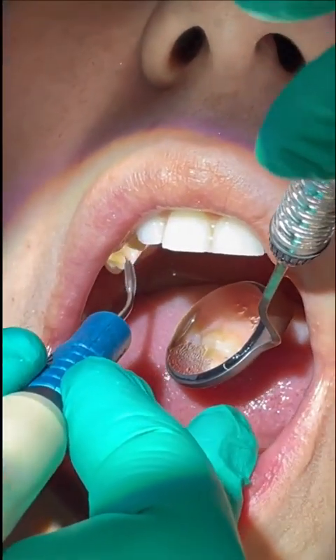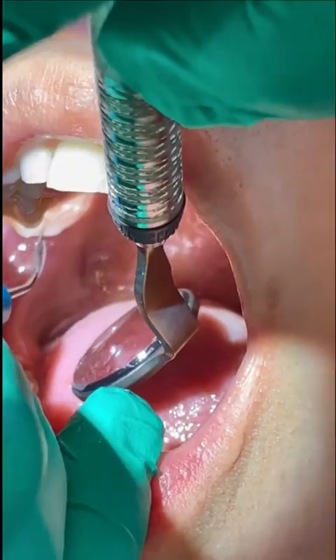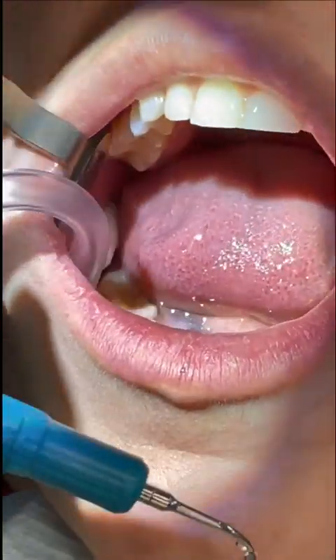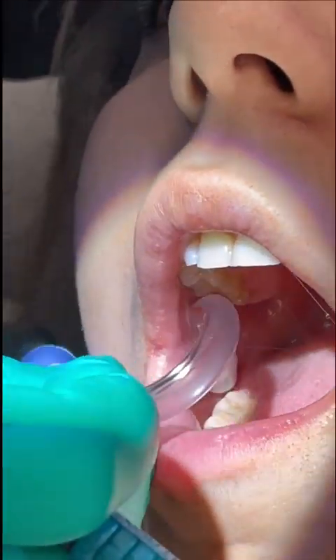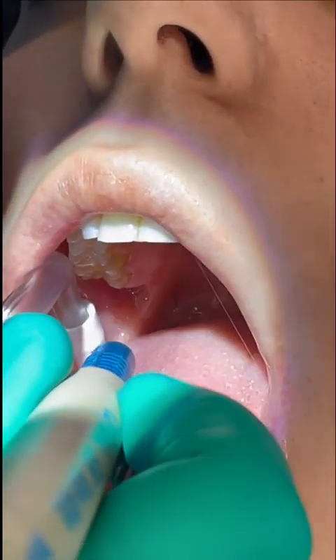You'll notice that I'm using a cross-arch fulcrum. I don't do that for hand scalars, only for ultrasonics. Now for the last quadrant, I'll simply reverse the bends in the suction and continue in the same way. The only difference here is that it's more comfortable for me to do the anterior surfaces of the lower right side at the eight o'clock position as opposed to the 12 o'clock position.